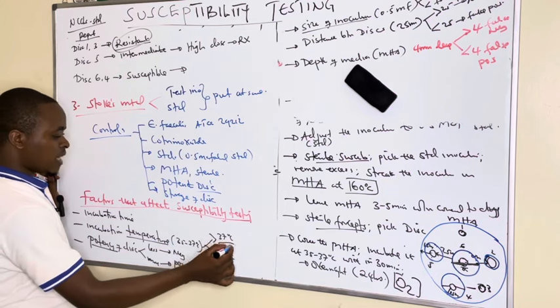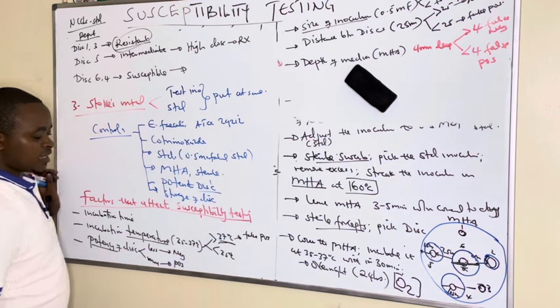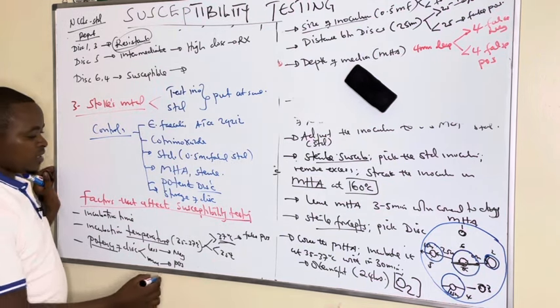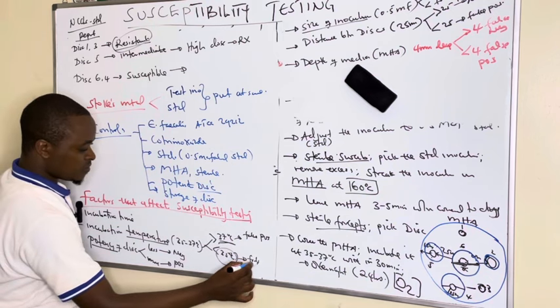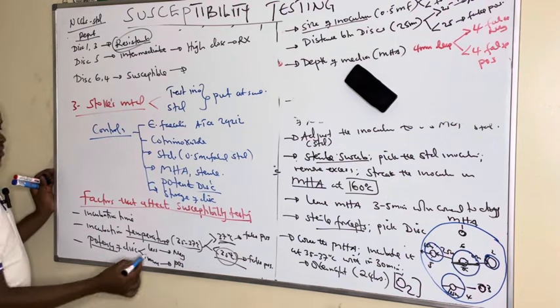Some microorganisms that do well at higher temperatures can give false results, and those which cannot grow at higher temperatures give false negative, and even below, it gives false results because the growth will not be adequate. So the standard should be this.